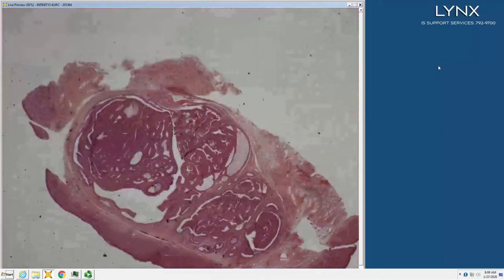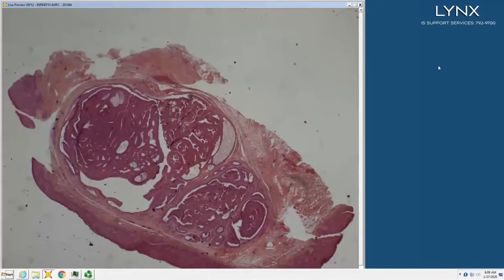So intraductal papilloma or erosive adenomatosis of the nipple is essentially HPAP in the breast. Oh, so it's essentially the same thing, right? So it's just nipple adenomas and HPAP in the duct. Background of the smooth muscle. Background of smooth muscle, background that would suggest that it's breast. But it's basically the same thing. It's a papillary adenoma of the lactiferous duct, just like an HPAP.